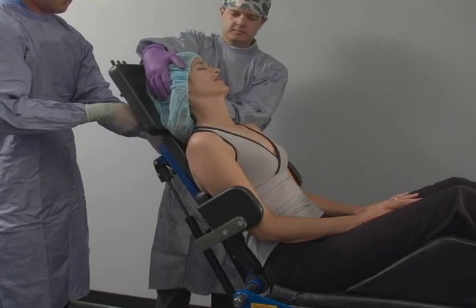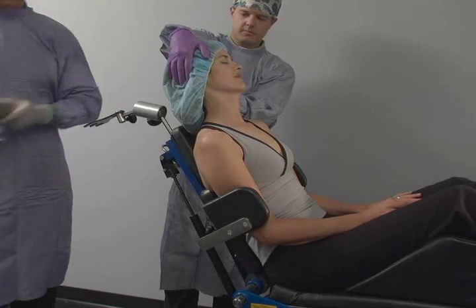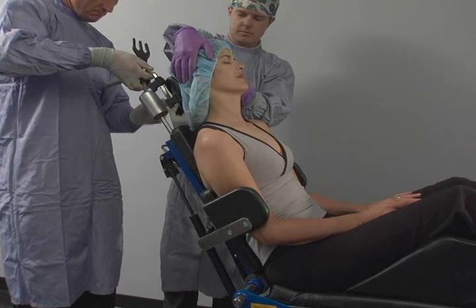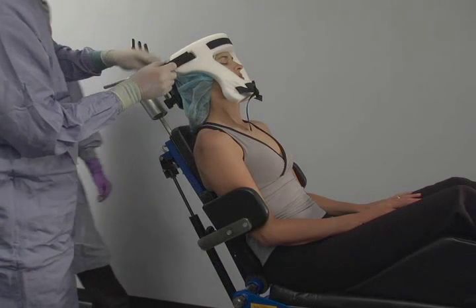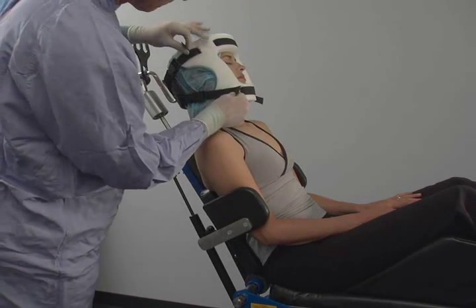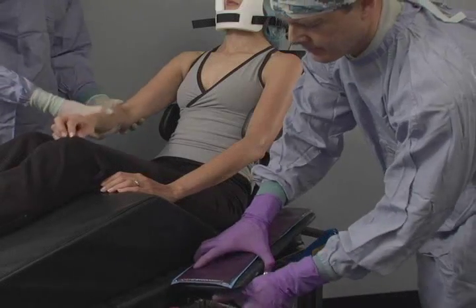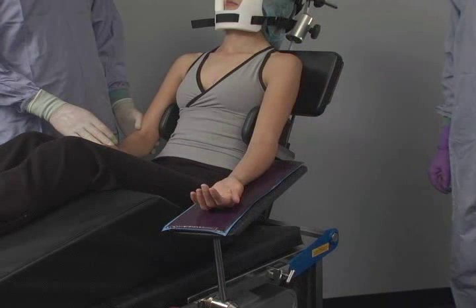Once the patient is intubated, the anaesthetist controls the patient's head while the TMAX is raised to a sitting position. If the intubation pad is used, it is tilted as far back as possible and pulled out of the forward slide collar. The surgical headset is then slid into place and adjusted to put the patient's head in a neutral position. The disposable mask is placed over the patient's face and tightened, ensuring the mask is not applying pressure on the patient's eyes and that pressure is evenly distributed on the face. Do not over-tighten the straps on the mask. The patient's arms are then taken out of the lateral supports and the arm board is inserted into the Clark clamp on the non-operative side, placed parallel to the table directly under the arm, providing great access for the anaesthetist. The patient is now positioned and ready for prepping and draping for the surgical procedure.